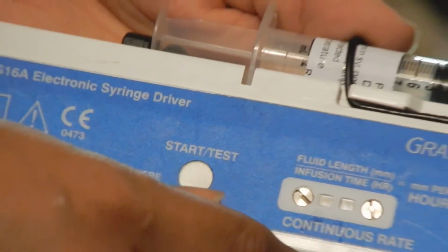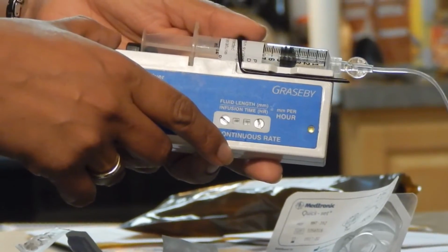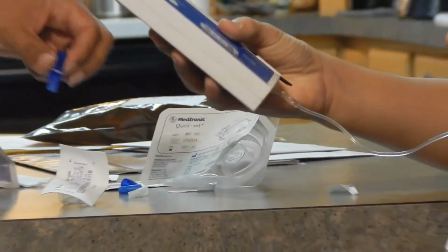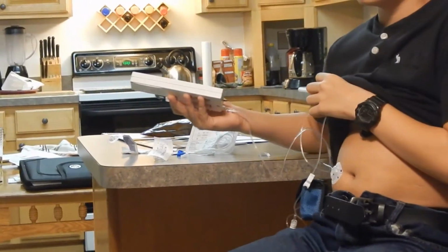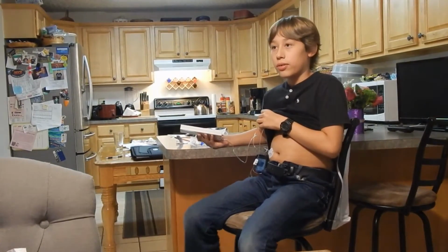And then later, the next day, when it turns off, it makes a ding sound, and that light stops flashing. That is the most important indicator, whether the light is flashing or not. And you're done. And so that is how you do the Desferal injection, in case you don't know how, for any reason whatsoever. So, yeah.